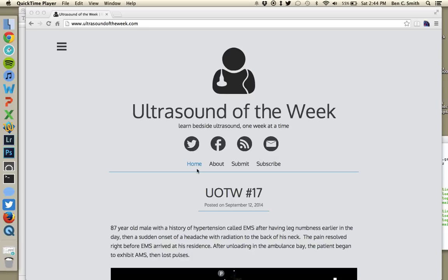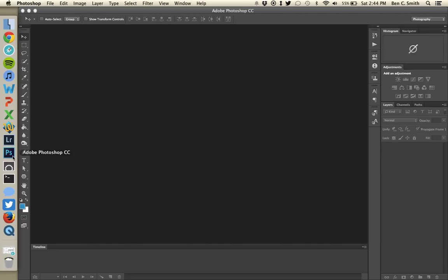Hello, this is Ben Smith from ultrasoundoftheweek.com. I've been asked by a couple of people recently how I create animated GIFs for posting on the internet or on Twitter. I wanted to create a quick video tutorial on how to do that. The tool I use is Adobe Photoshop — I think it's the most flexible, gives you the best control over the quality and size of the GIF. Today I'm using Adobe Photoshop CC.